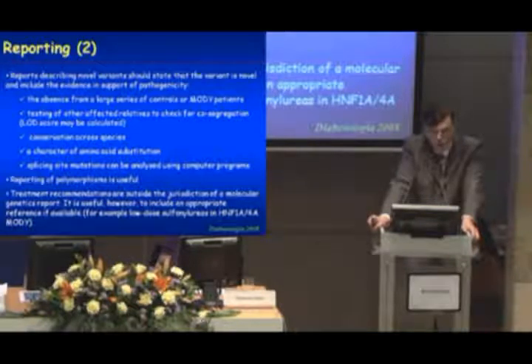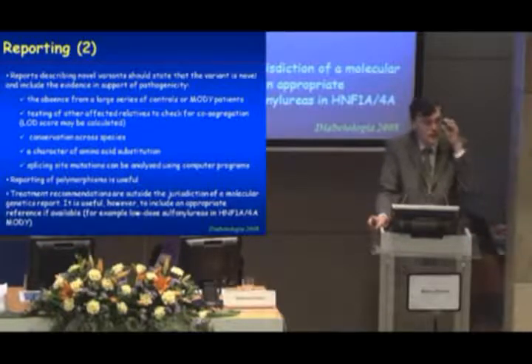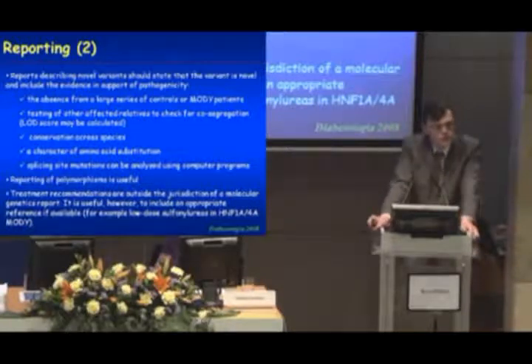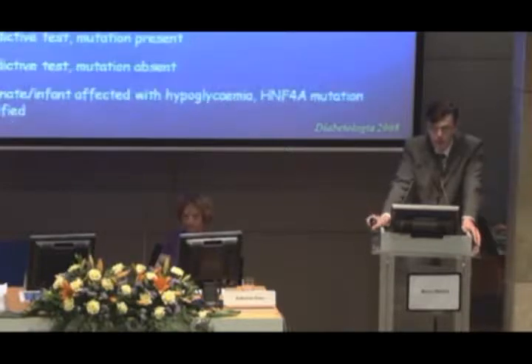Reporting of polymorphisms is useful, however, it's not mandatory. Treatment recommendations are outside of the jurisdiction of a molecular genetic report. In other words, when issuing the laboratory reports, we should not be including any clinical recommendations as far as, for example, medical care is concerned. It is useful, however, to include an appropriate reference if available.